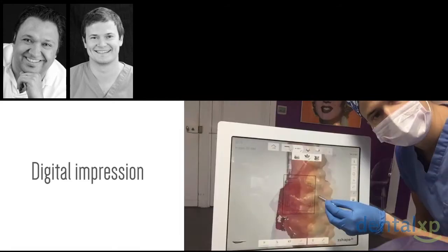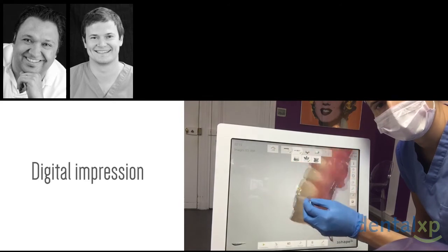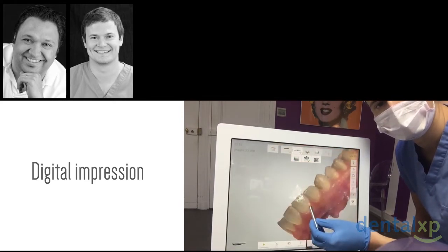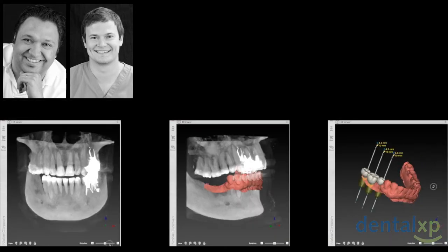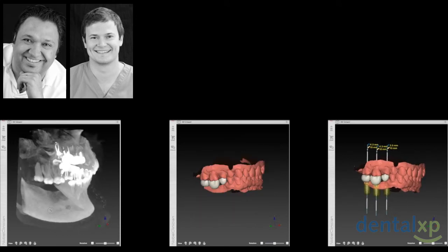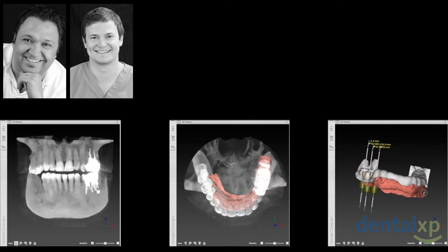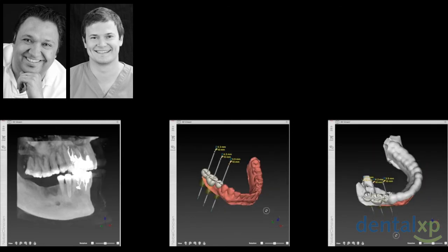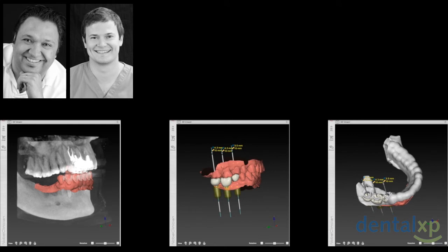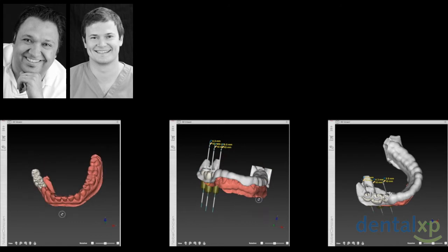And now we are going to be able to integrate this digital impression into our workflow to plan for the next steps in our treatment plan. So basically, what's this fully digital workflow? The first thing is that we can now merge the STL file from the digital impression to the DICOM file of your patient, just as we did with the STL file from the lab scan before.